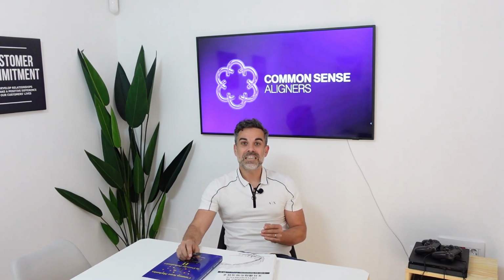They're integrating CBCT already, and it's quite simple to insert a DICOM file into a digital treatment plan. And they are creating a whole environment that, even considering it might not be absolutely perfect, is fast, quick, and convenient. And I would say in 98% of the cases, we just need to take a brief look at these aspects.